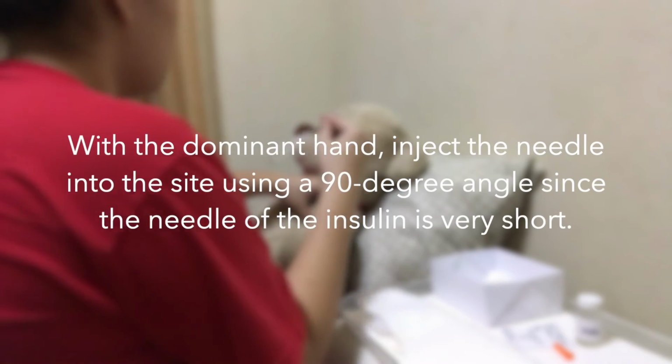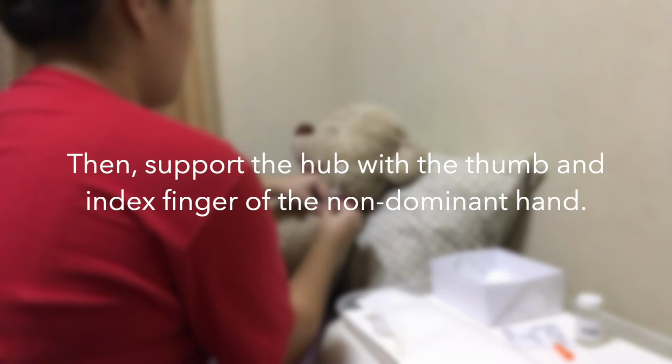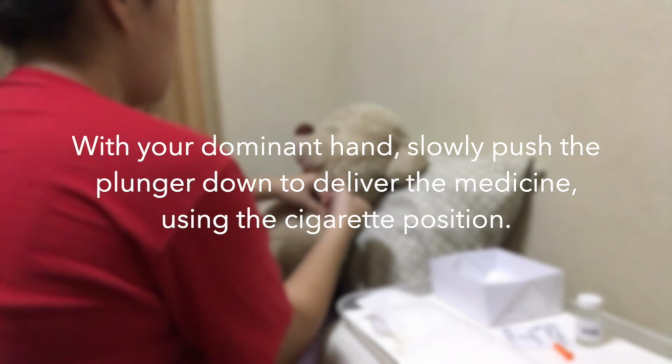With the dominant hand, inject the needle into the site using a 90-degree angle, since the needle of the insulin syringe is very short. Then, support the hub with the thumb and index finger of the non-dominant hand. This prevents the hub from being pulled out of the skin. With your dominant hand, slowly push the plunger down to deliver the medication, using the cigarette position.